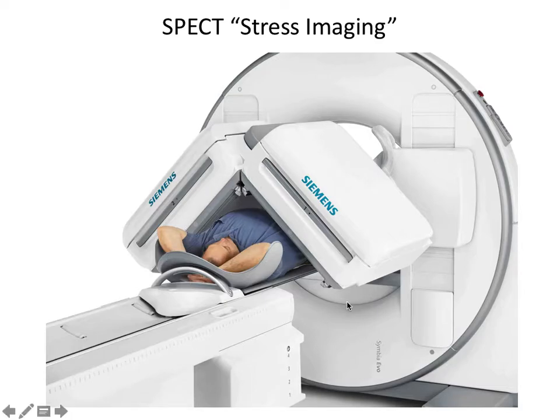So here you see two detectors approximately 90 degrees apart, and this entire structure is on a gantry which will rotate those two detectors around the patient, right? And so radiation comes out, gets detected here, and you sit in that location for some time. You rotate the detectors and sit there for some time and just collect radiation as it's coming out of the patient. And this process takes a few minutes to tens of minutes to collect all of this radiation.